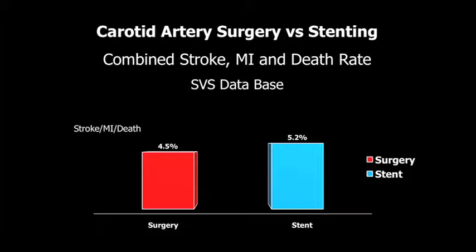And the answer is that things are very similar, and you have to pick your point of what is important in stenting versus endarterectomy. The studies would suggest that stenting is equivalent for risk of death, myocardial infarction, heart attacks, and strokes over a period of time. However, there may be some differences in the various risks of the various procedures in various groups.